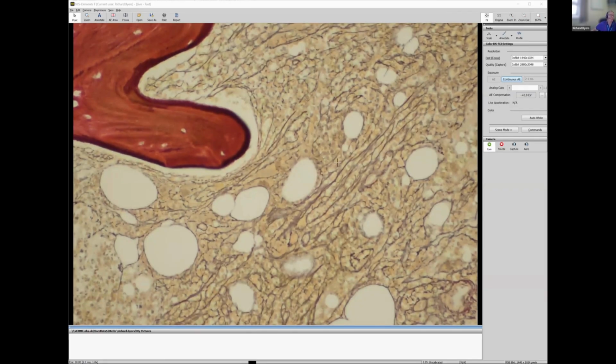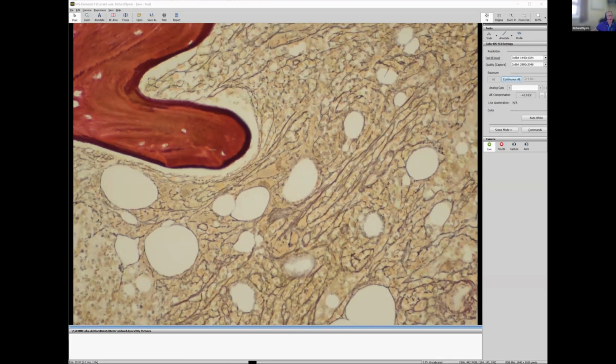So we have thickened bone, which is part of the osteosclerosis, is part of the WHO classification criteria for myelofibrosis. And then obviously the collagen here is stained kind of magenta pink color. And you can see there's a slight magenta tinge in these cells here. They're not just quite jet black. They've got a slight purple haze to them, particularly there around a blood vessel. But in this area here, again, a purple haze.